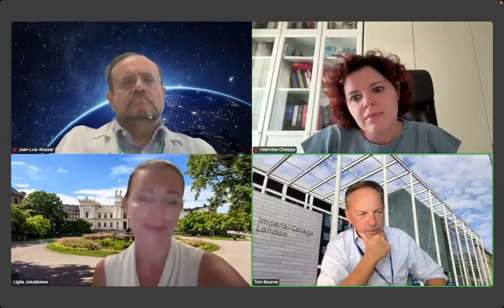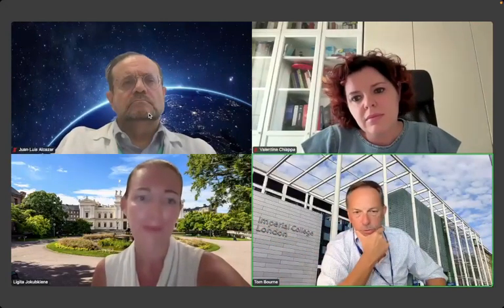Excellent. I don't think there are any other questions from the floor. I found that absolutely fascinating, and I think it really does play into the theme of the webinar, where we're now seeing some of these tools actually changing clinical practice and, I'm sure, making life quicker as well.